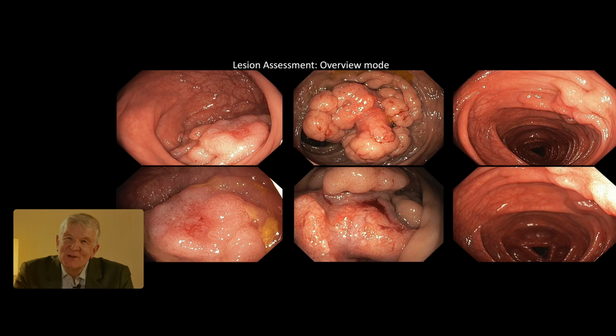But we know, I don't know if you want to look. No, later. We'll have hearty congratulations to the French, but we'll have a separate session on that. But if you look at all those, there's a high suspicion of malignancy.